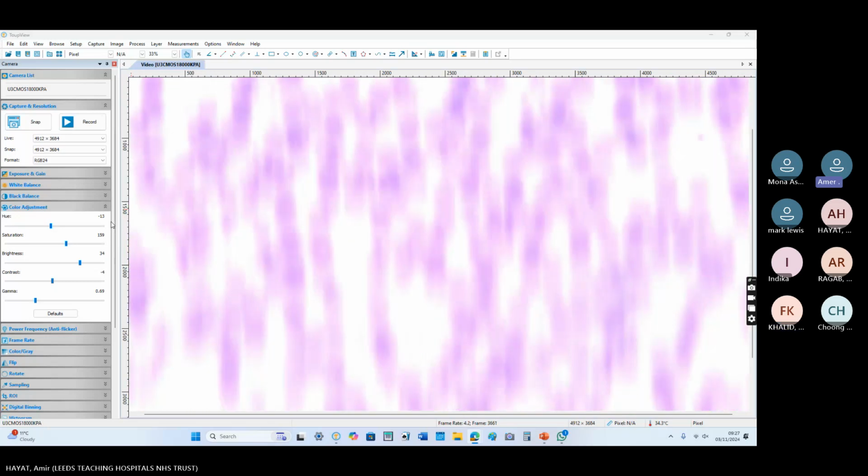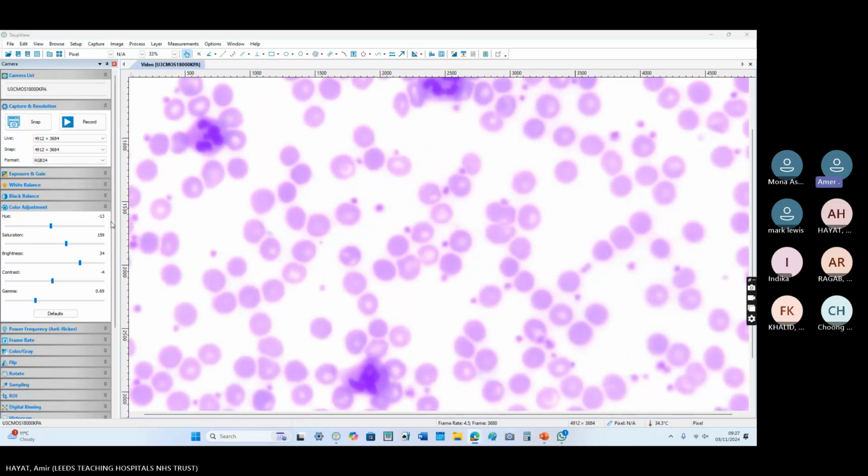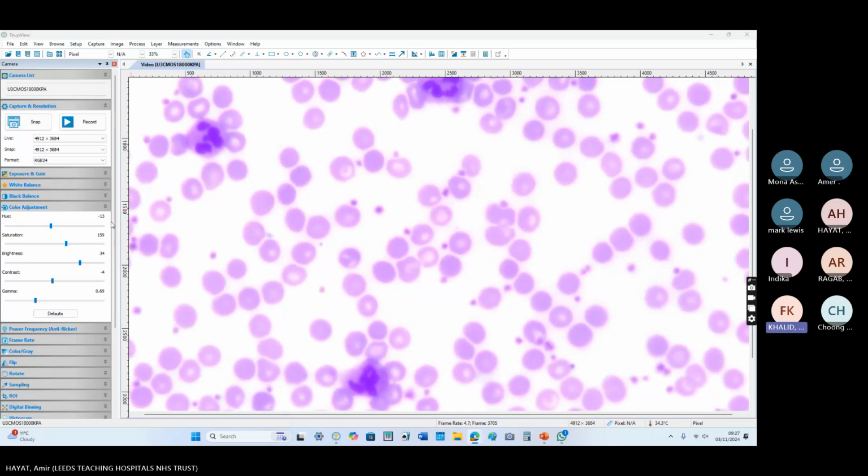What do you do in this patient? Yes, there are target cells definitely. Because hematinics include iron and B12 and folate, the doctor has mentioned hematinics, so let's do folic acid and B12. I would usually write hematinics including iron, B12, folate, the full package.